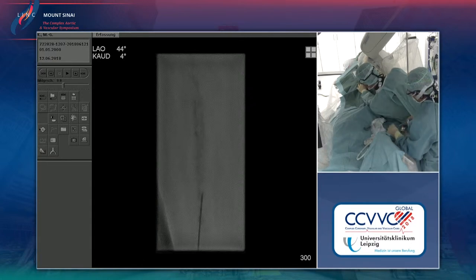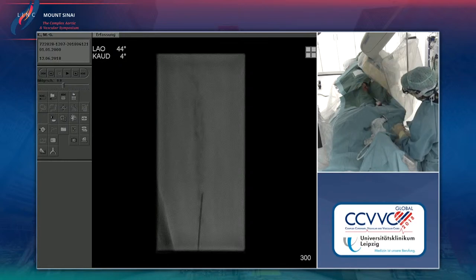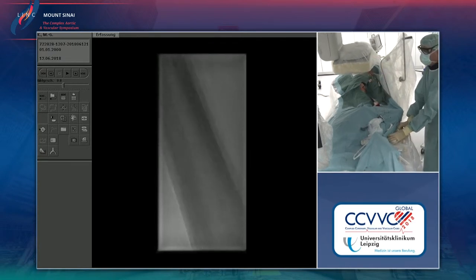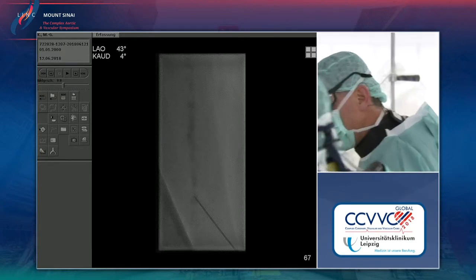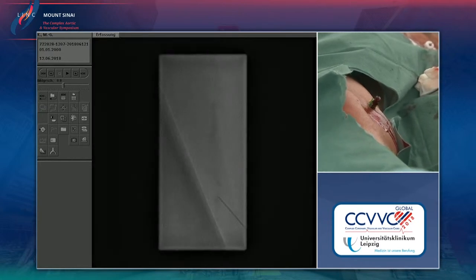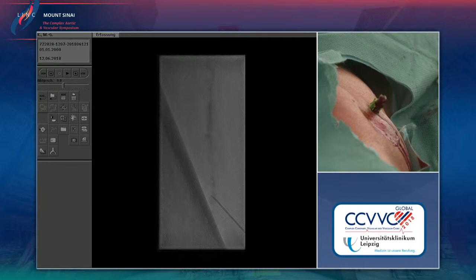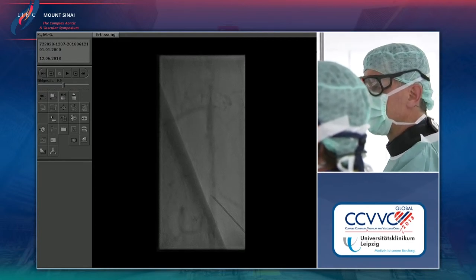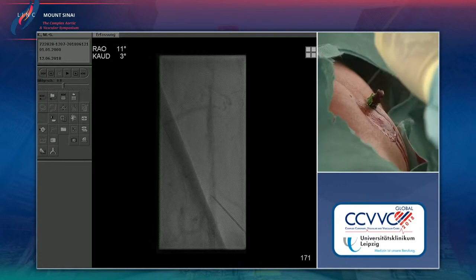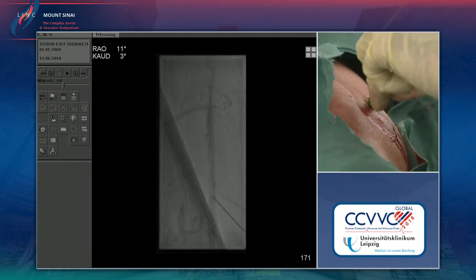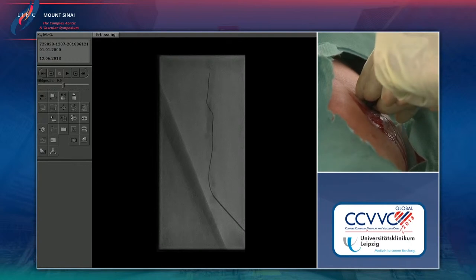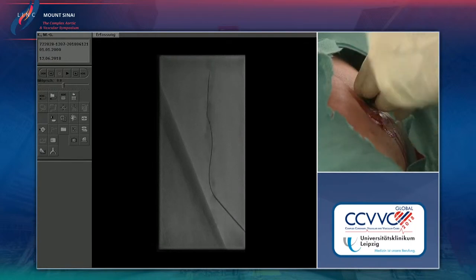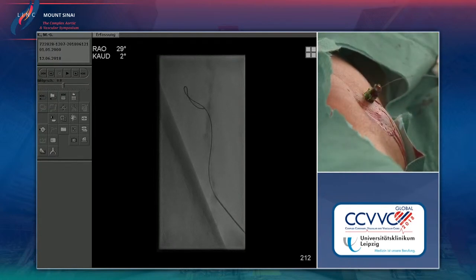I think I'm somewhere in an artery — there is a little bit of flow going out. Let's see whether a wire goes in, maybe a V18. Well, that could also be difficult to take any device in. Let's try it with an 0.018 guide wire. This is obviously a collateral. Why not land the wire here in the collateral and then try to take a catheter in?